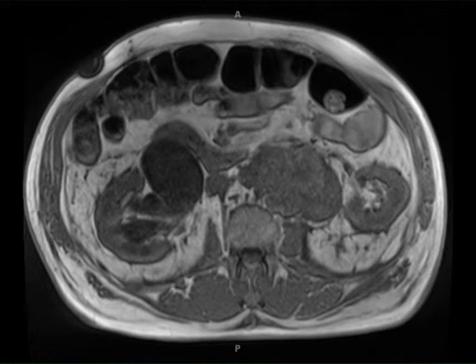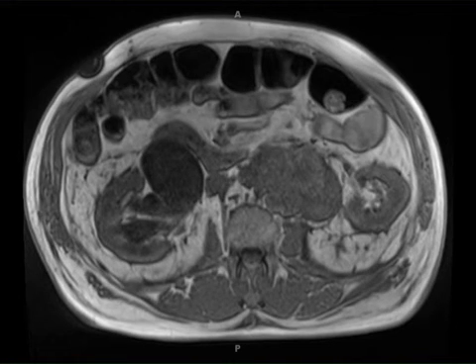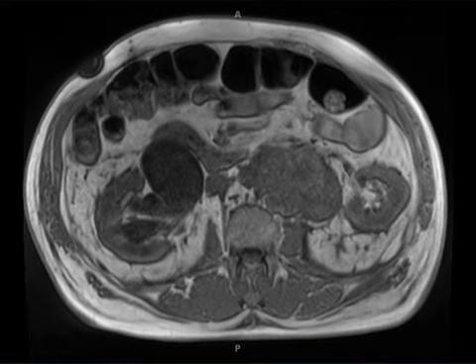This is a 56-year-old male with a history of chronic abdominal and lower back pain. The patient underwent MRI of the abdomen and pelvis with and without contrast for evaluation of his symptoms.